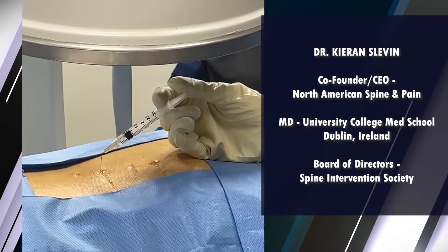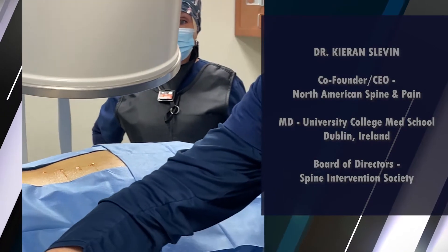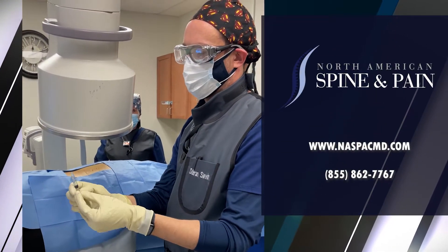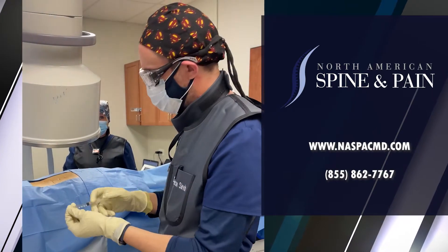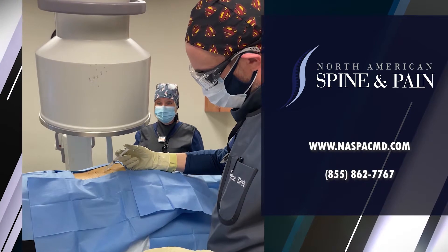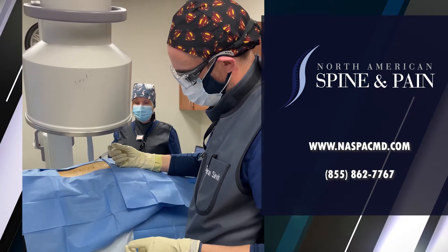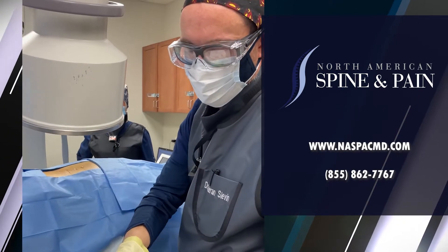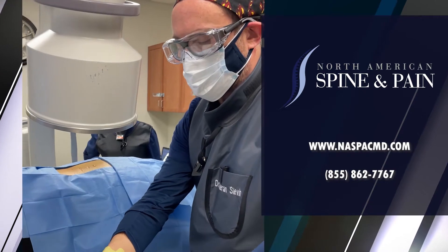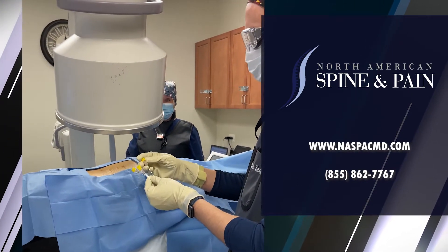When we get the radiofrequency probes in position, we actually need to make sure that the neural structures — the dorsal rami — are not denervated with local anesthesia, so that we can test and make sure that the needle is in the correct position, close to the dorsal ramus, in order to get maximum pain relief and the best outcome. We're going to use 10-centimeter yellow radiofrequency probes here.